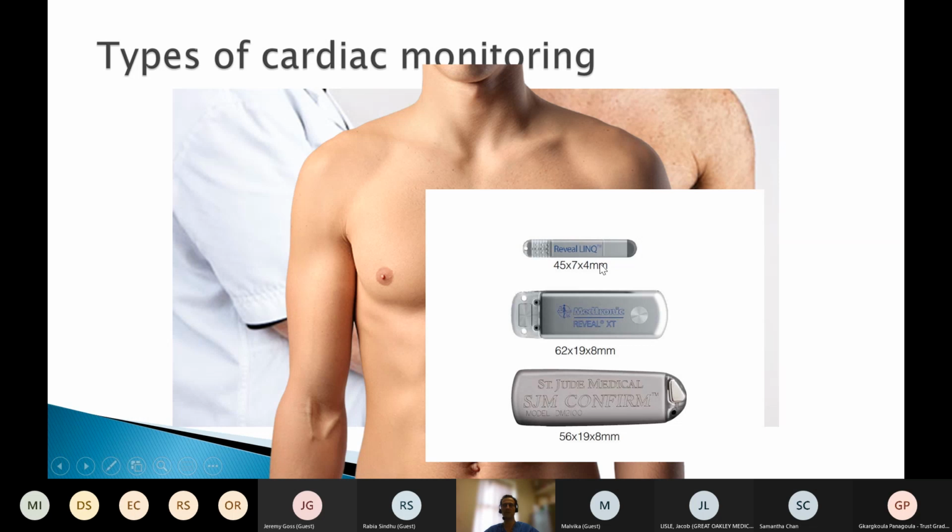the patients to complete a diary so that you can look at when they get their palpitations, at what their heart's rhythm is doing, because actually knowing their heart rhythm is normal when they've got their symptoms is extremely helpful, or knowing that what you're not sure if you need to do something about or not, if it's a 3-second pause, is that causing their symptoms or not? Probably not is the answer, but correlating that with their symptoms is really valuable.